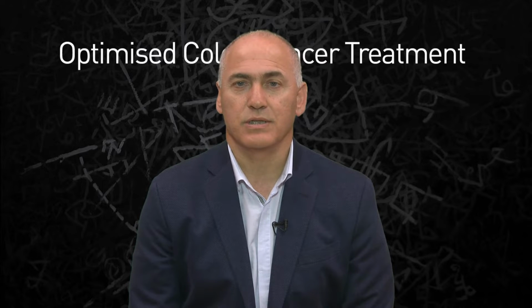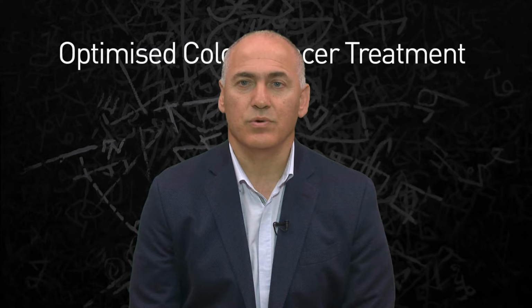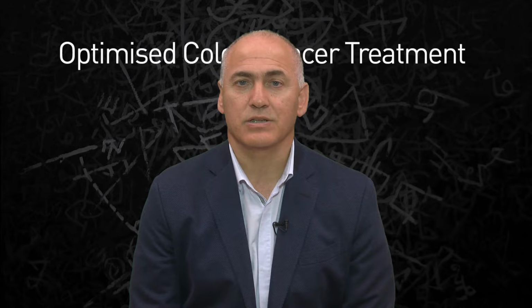In minimally invasive surgery, surgeon's preference can be various regarding the port setup and the surgical team's position. Exploration of the abdominal cavity for the extension of the tumor, distant metastasis, and any metastatic peritoneal deposit has a crucial role in the management of colon carcinoma and must be performed before starting any dissection.